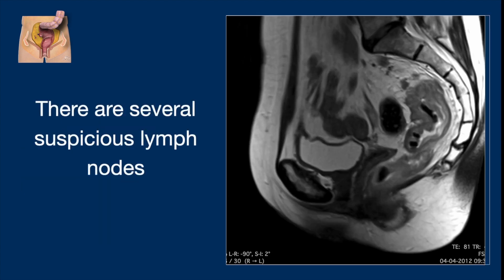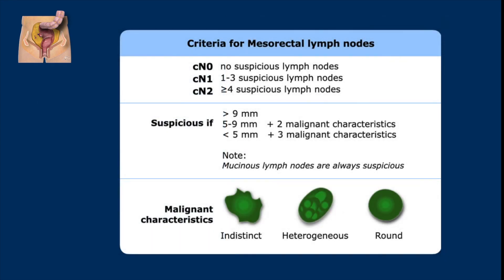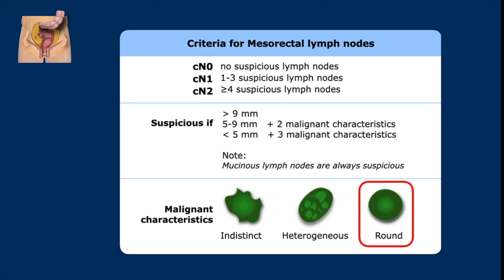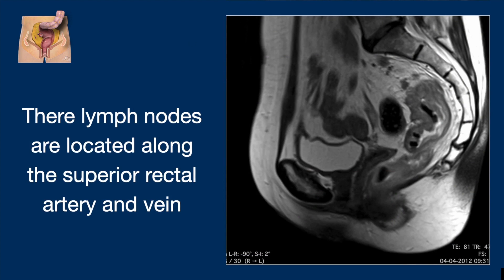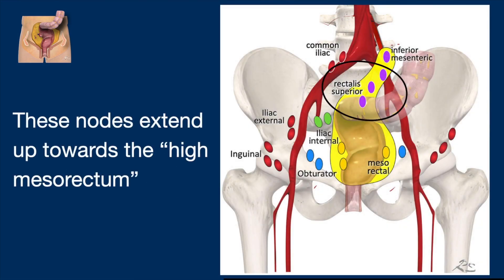Now let's look at the lymph nodes. There are several suspicious lymph nodes here. The criteria for mesorectal lymph nodes are as follows: look for malignant characteristics like indistinct border, or when the lymph node is heterogeneous or round. When you have these three malignant characteristics, even nodes smaller than 5 millimeters are very suspicious. With only two malignant characteristics, nodes between 5 and 9 millimeters short axis are suspicious, and all nodes larger than 9 millimeters. All mucinous lymph nodes are always suspicious. These nodes are located very high along the level where the superior rectal artery and vein are located, which is important information for the surgeon, as they are sometimes not resected in standard total mesorectal excision.